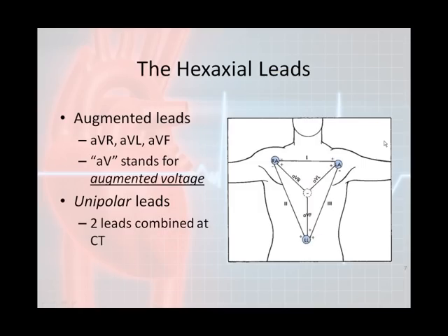Those 3 leads are the first 3 leads that were really ever researched. So what we're going to do now is talk about the other 3 leads that are part of the hexaxial leads: leads AVR, AVL, and AVF.